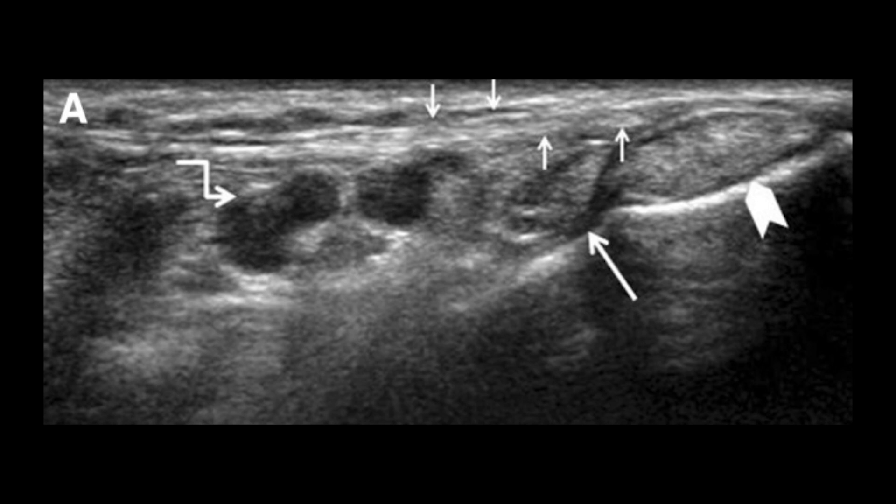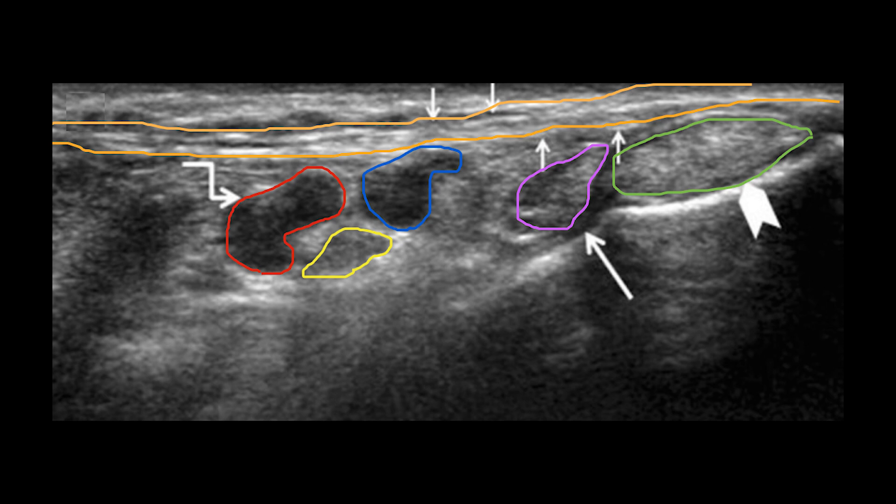Here you can see a sonographic image of the medial retromalleolar area obtained in the axial oblique plane. Superficial to the bone, moving from anterior to posterior, one can see the tibialis posterior tendon indicated with the green circle, the flexor digitorum longus tendon indicated by the purple circle, the neurovascular bundle — red for the posterior tibial artery, blue for the posterior tibial vein, and yellow indicating the tibial nerve. The short arrows with the orange strip appear as a thin echogenic band — this is the flexor retinaculum, which is superficial to all of these structures.